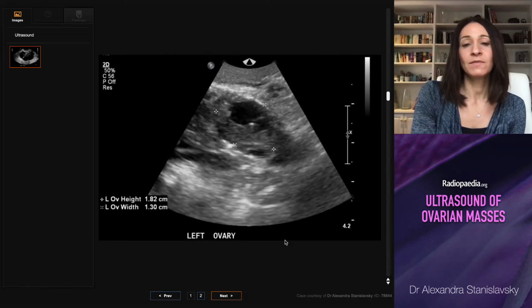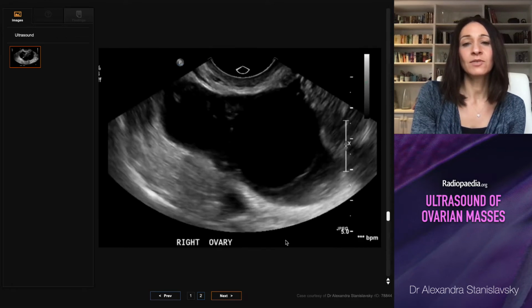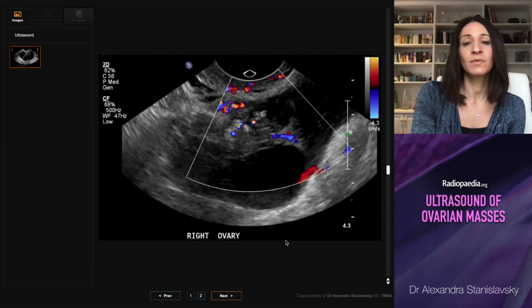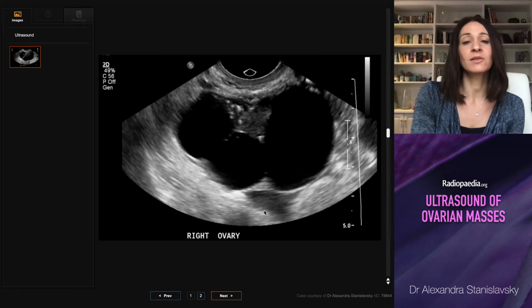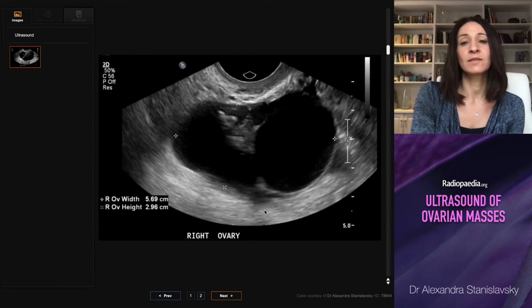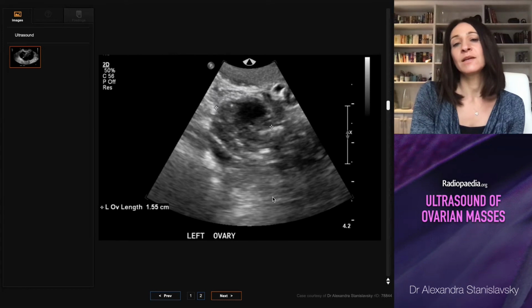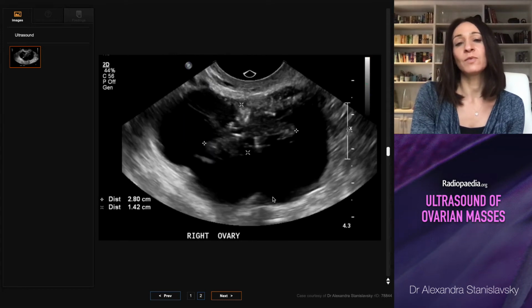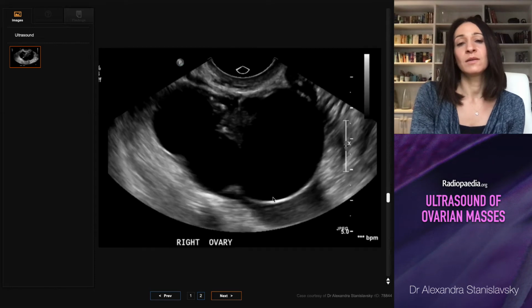So we have a multilocular tumour with a solid component and internal vascularity. So it's a multilocular solid. Somewhere here we've got the size of it, 5.7 centimetres. Vascularity score, so sort of moderate. So maybe we'll give it 2 or 3. A few septations have got colour in them.